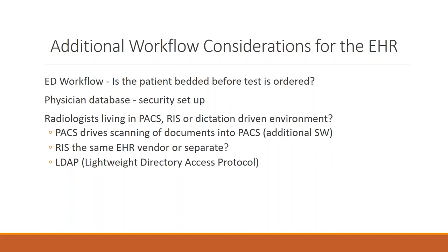The PACS drive, scanning of documents, additional software. You're going to need some sort of a DICOM scanner. What are you doing with that piece of paper today? You can't lose it. You need to still keep this information going to the doctors, and you're going to have to test those and make sure you have locations. Lack of PCs, lack of scanners are very easily overlooked, because you're trying to expand your department, and you have to look and see the congestion of your technologist workflow. Make sure that there's enough of these pieces at the beginning, or you start losing that built-in tendency to use the hardware and software.